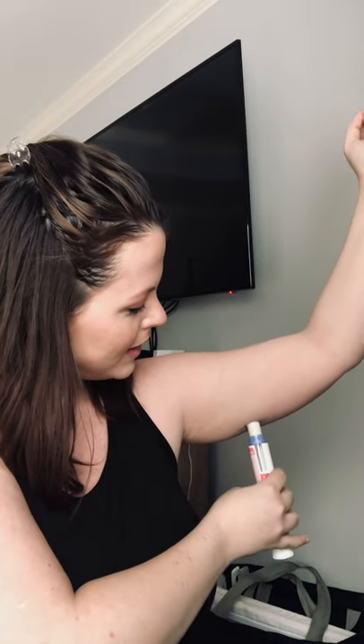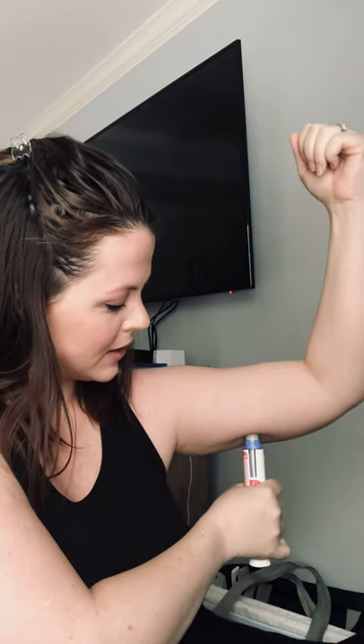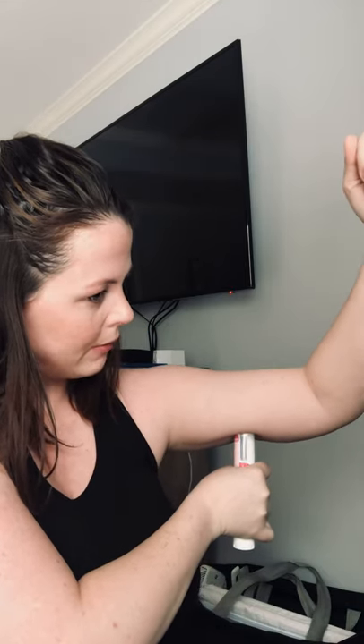So you're going to put it in place, then keep your hand at a 90-degree angle and press it up. And when you hear that click, that means the medicine is going in. See that orange bar going all the way up to the top? This part doesn't hurt. Then you'll hear another click — and your shot's all done.